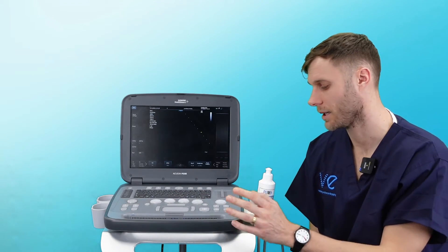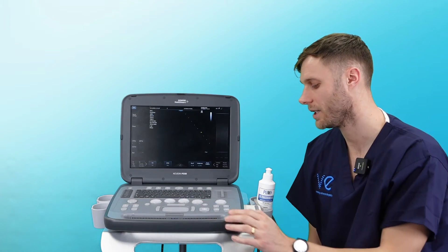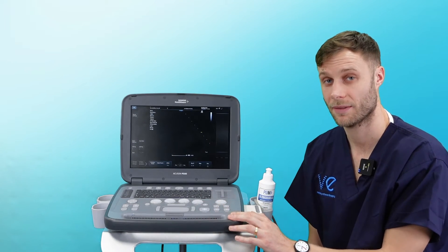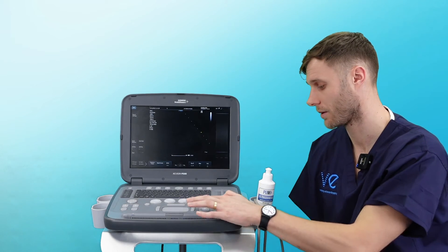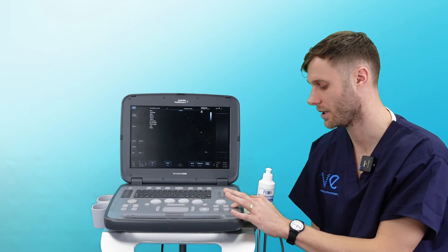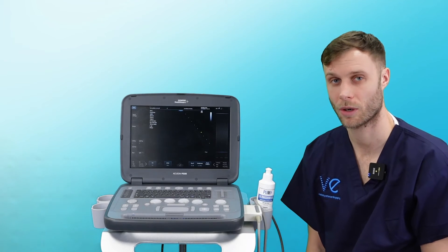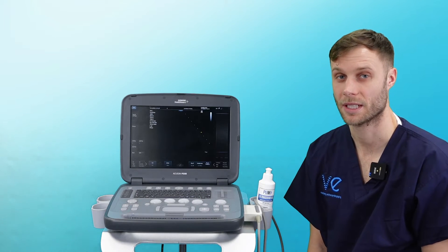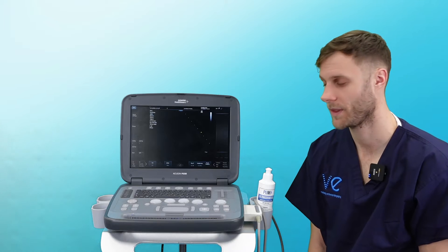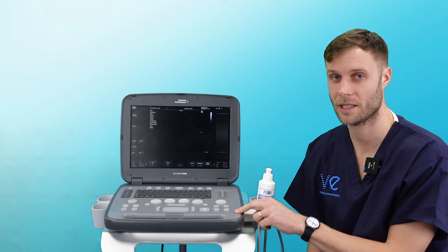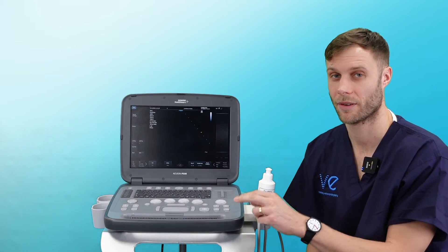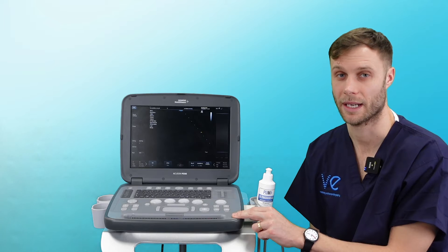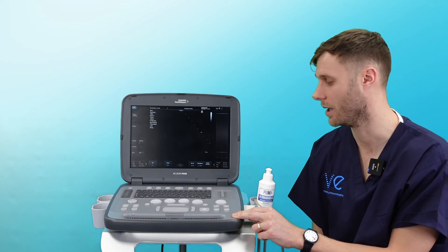When you're scanning and you want to save an image, you can freeze, print, or Store — Store 1 will save a still image. Or when you're scanning, just hit Clip Store and that will save a cine loop of a few seconds as a video clip. If you have ECG plugged in, you can set that up to save by heartbeats instead, so it will save heart cycles.